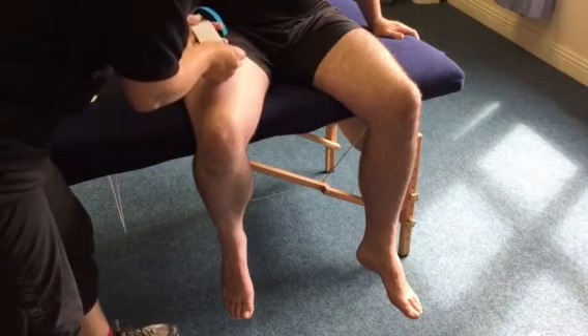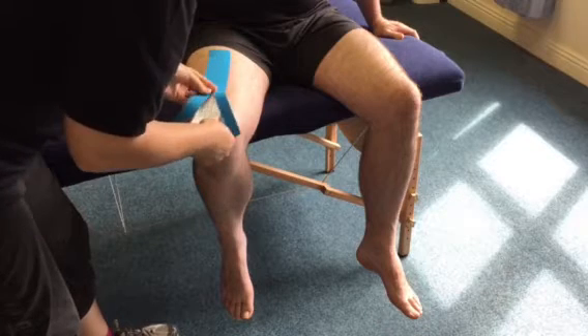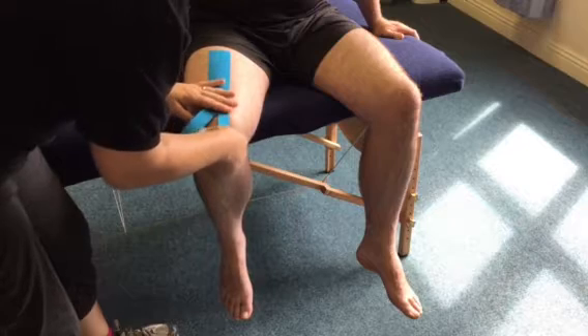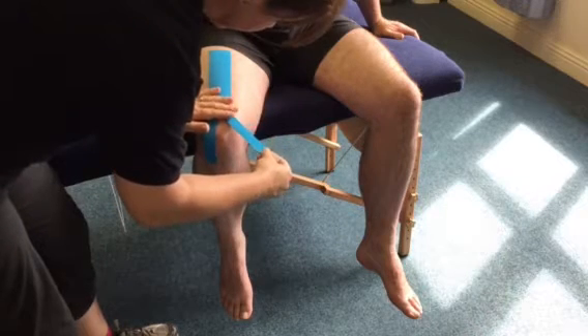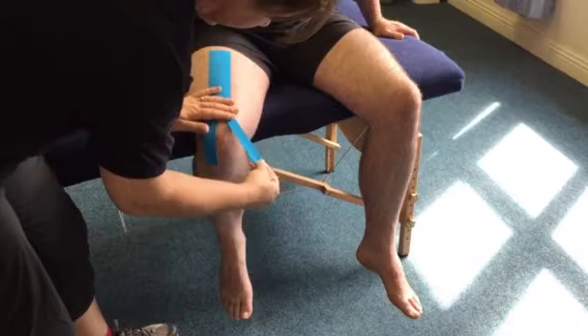Now I'm going to unroll the backing paper and come down along — no real stretch on the tape down along the piece of muscle. On each of these individual little legs you can put maybe 20 to 30 percent stretch; 100 percent, back off to half which is 50, then back off again to about 25 percent.